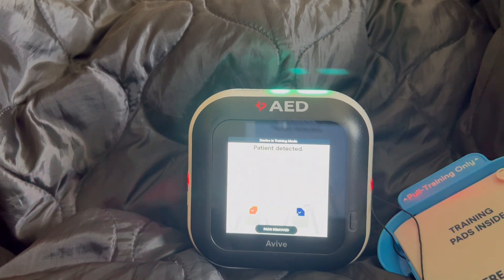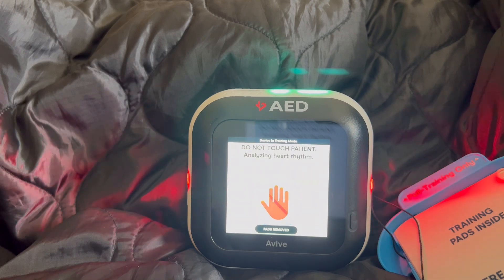Patient detected. Do not touch the patient or pads. Analyzing heart rhythm.